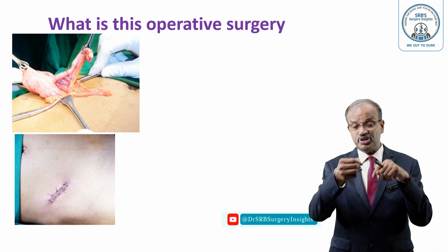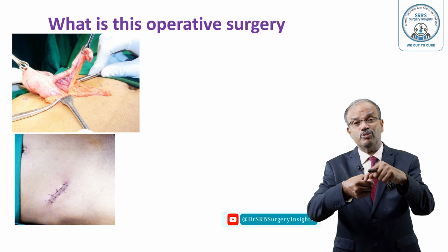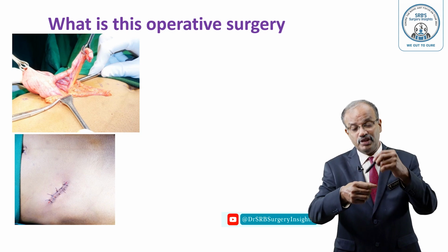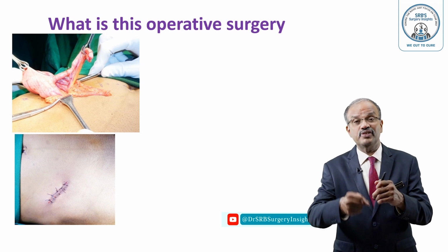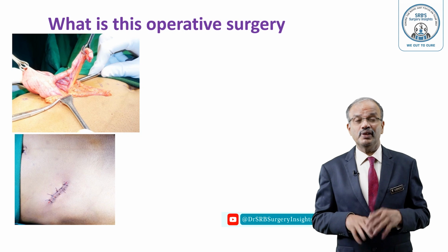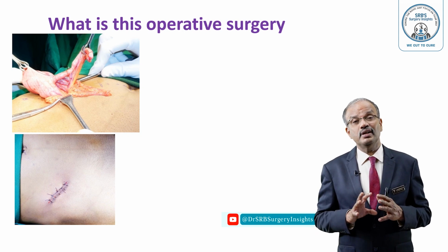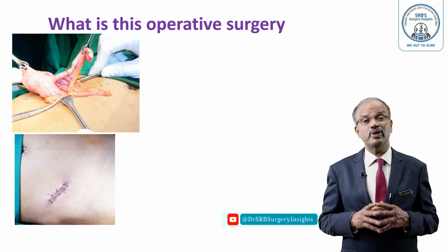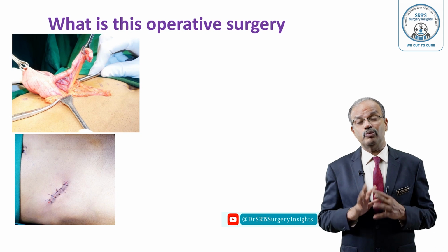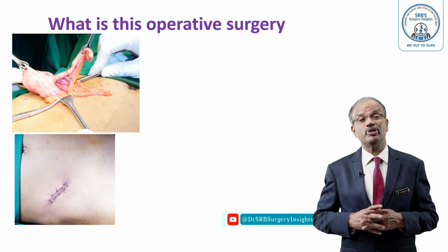In the olden days we used to put a purse string suture with vicryl around the base of the appendix, within a centimeter surrounding it. Then we tighten that, and the assistant will push the stump and it will get buried inside. Otherwise, seromuscular Lambert sutures can be placed to bury it. Now currently it is confirmed that burial is not necessary, so most of us won't bury it. The same holds good for laparoscopic appendicectomy, where 2 endoloops are placed and burial is not done. If somebody wants to bury it, you can do a purse string suture or 2 Lambert's seromuscular sutures, and it gets buried.